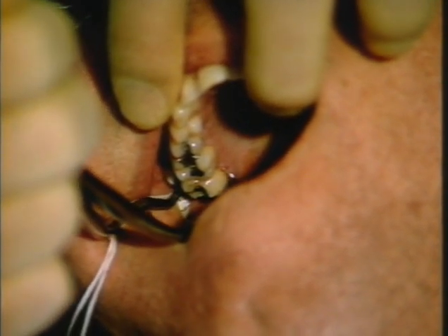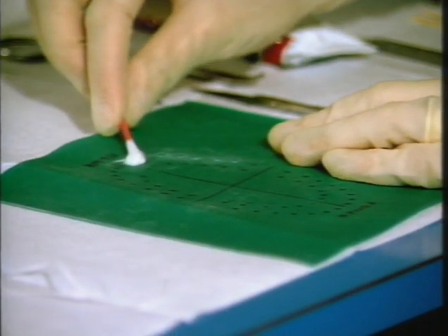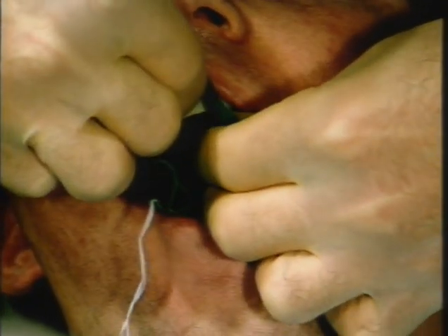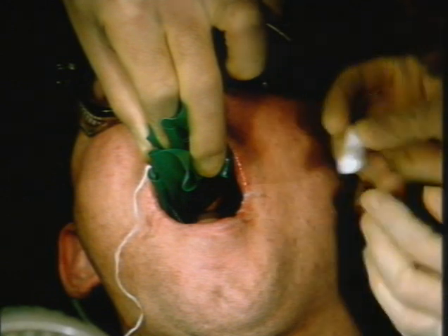Obviously the clamp has to be put on very gently, but one can't avoid sometimes a noise as the forceps are released. This last molar is a very long way back, so it's quite a stretch to get the rubber dam over the bow of the clamp. He's just working a little rubber around the back there. Patients really appreciate the Vaseline on the corners of the mouth.